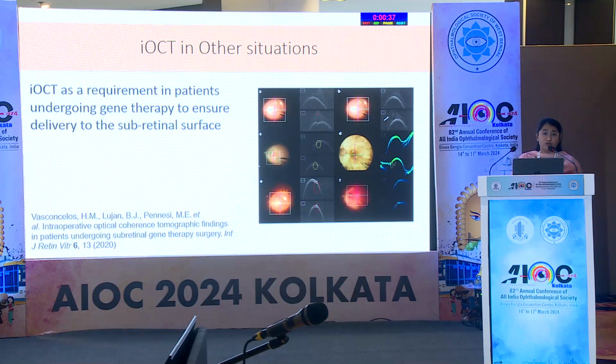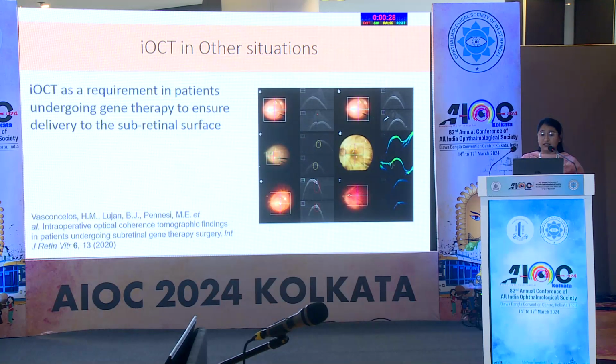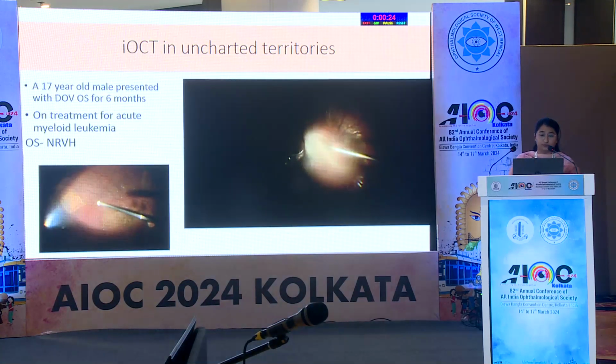In other situations we would be talking about gene therapy and retinal prosthesis. So we need to ensure that for gene therapy, the delivery is in the subretinal space, and for the Argus 2 implant to be epiretinal. And then moving on into uncharted territory.